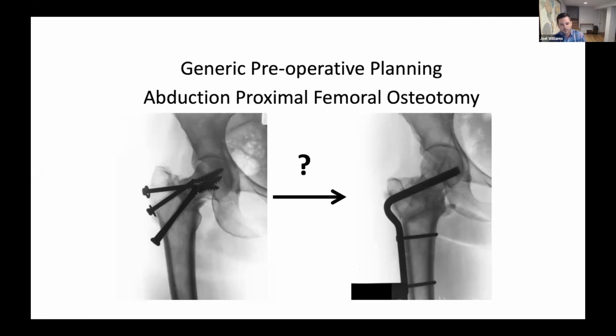Yeah, so I'll typically do both. The image as shown is without shoes or blocks. And then if the patient already has a shoe modification, I'll have them put it on and see what they look like, or if they don't, or maybe in addition, put some blocks underneath so I can figure out what their inequality is as precisely as possible.